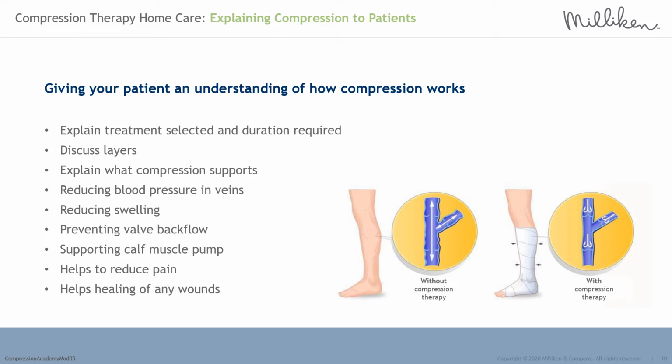Discuss the number of layers. Some patients may have heard horror stories of bulky and soaked bandages which unwind and smell from people who have experienced compression in previous decades. It is important to inform our patients that compression has come a long way, and a majority of effective bandage systems are now 2 layers. They are lightweight, breathable, not restrictive, and have been designed with the patient's quality of life at their heart.